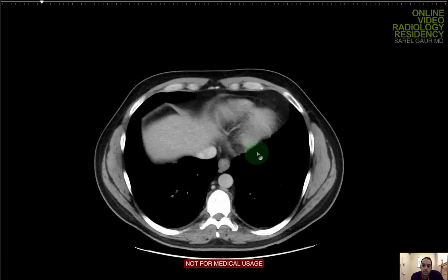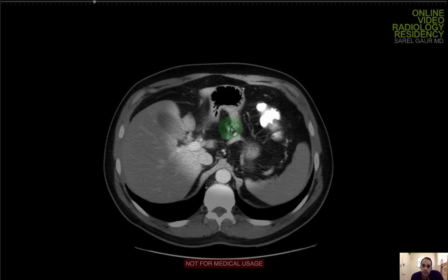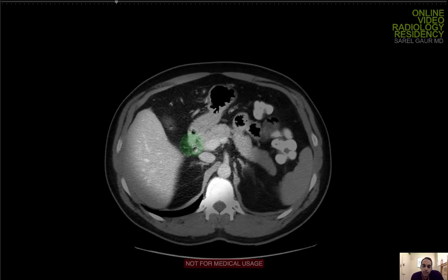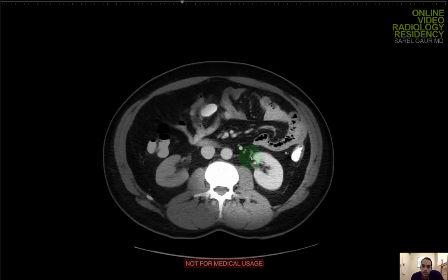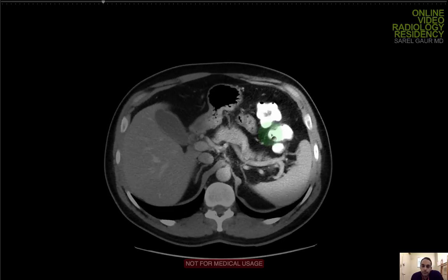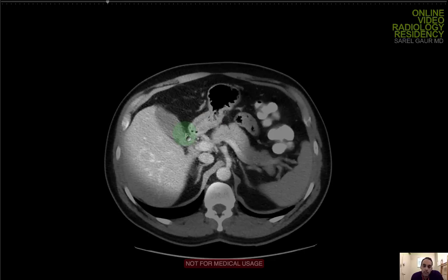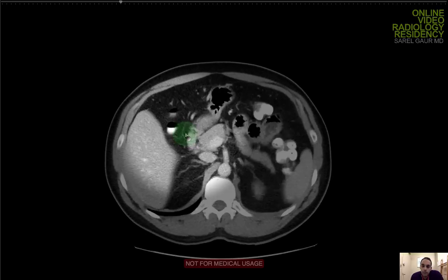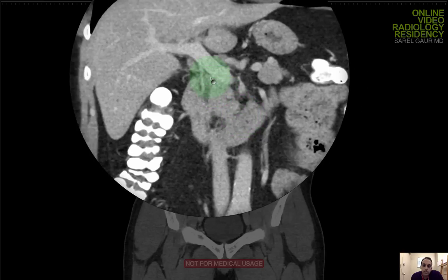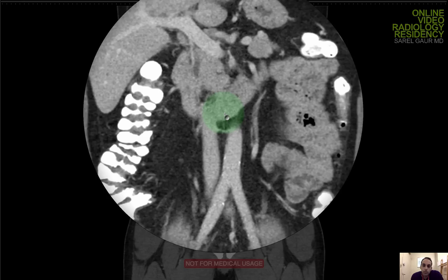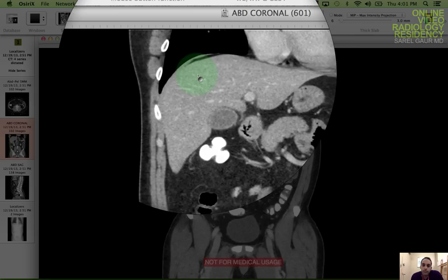Now I'm going to look at the stomach, starting from the gastroesophageal junction. I've got the cardia, the fundus, the body, and the distal stomach. Then the first portion of the duodenum, the second portion coming down, the third portion across the retroperitoneum, and the fourth portion coming into the jejunum. They look normal — no thickening, no ulcer disease, no inflammation. No evidence of malrotation because the duodenal sweep is normal. On the coronal plane you can see the second, third, and fourth portions of the duodenum, with the duodenal bulb visible near the porta hepatis.